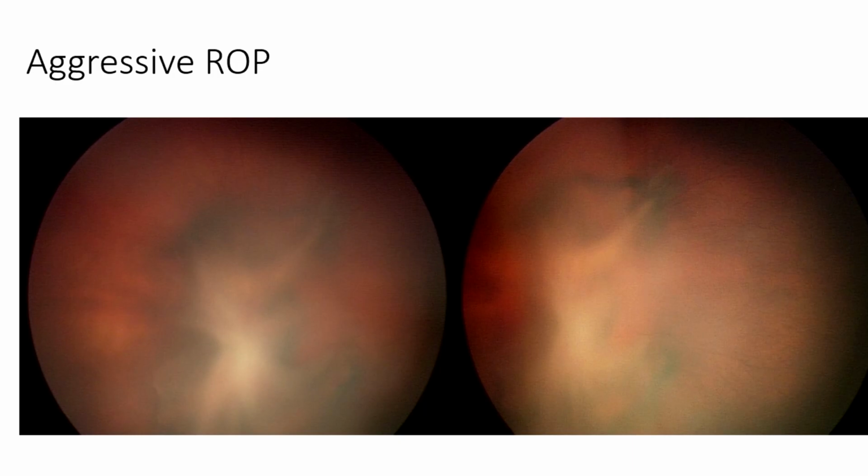This is aggressive ROP. See, you don't see anything. You just see a few little vessels around it. This is actually the disc area. See the fibrous tissue or the condensation going all the way anteriorly. It will go all the way anteriorly to the lens. This is something where you will treat with anti-VEGF and then you will do a lot of laser. Then ultimately you have to do surgery. You can see the tractional lines.